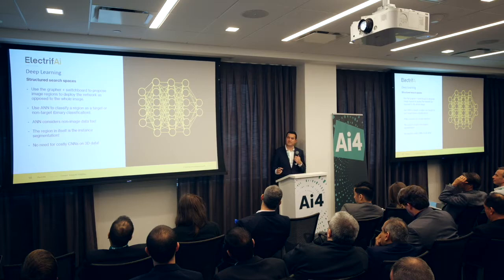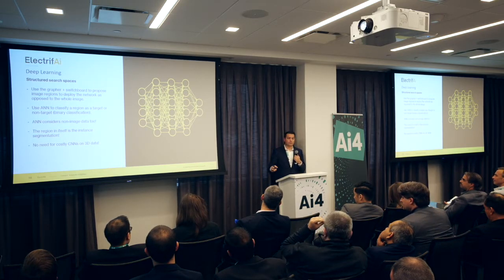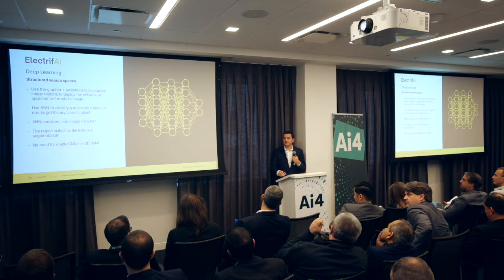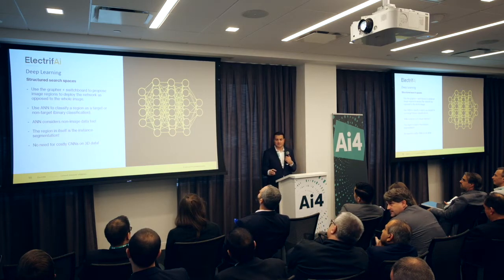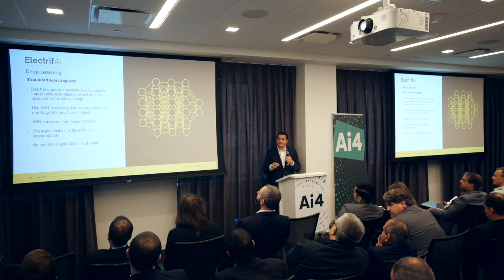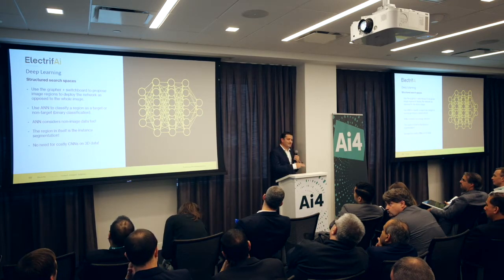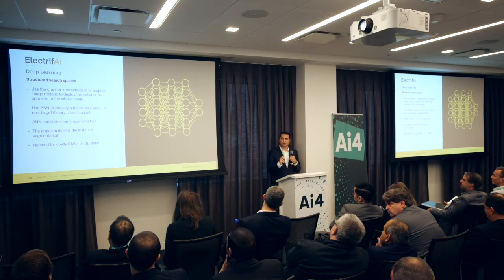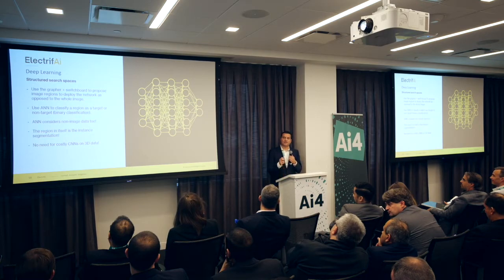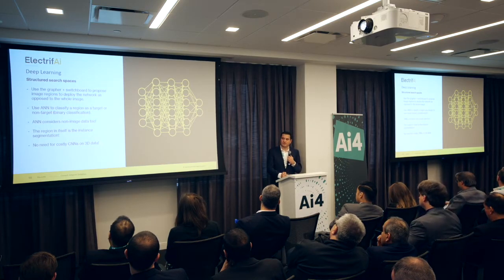which means that for any unknown photograph that is going to be thrown into that system, we will use the same technology as our segmentation stage to propose regions, and the classification of whether this is what we're looking for or not is going to be done based on the blood results. So we're actually having instance segmentation using artificial neural networks and driven by blood tests as opposed to image features. So we use artificial neural networks, not convolutional neural networks, and we train those ANNs with numbers that are pretty much the interpretations of the segments that we've isolated before in our training stage.